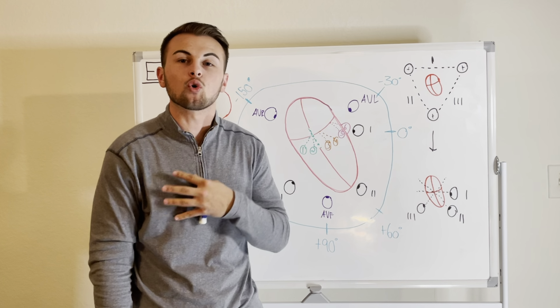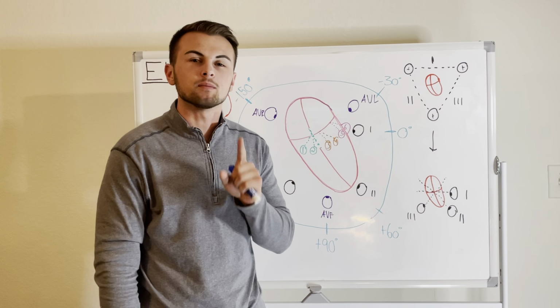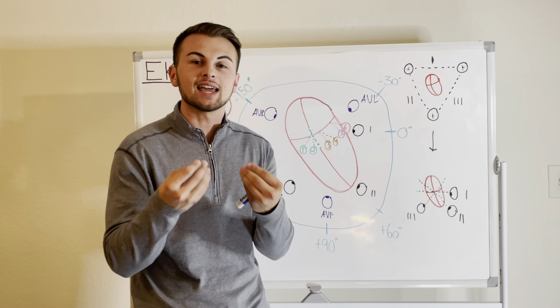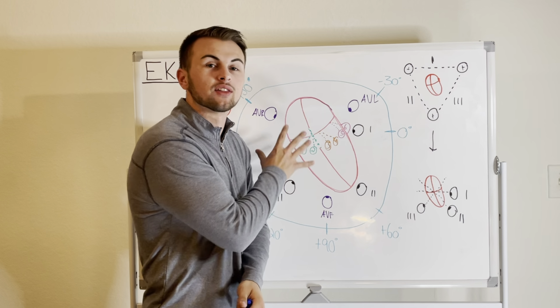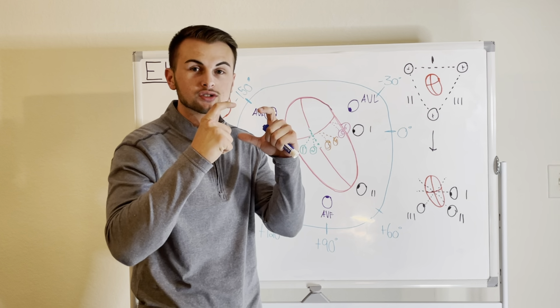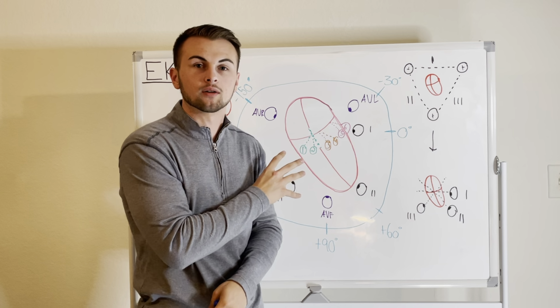we're going to go over the hexaxial system and the precordial system. Now, the most important rule today is that we must remember that the positive end of the leads are like cameras, and they take pictures of the electrical activity that is going on in the heart. That is what the EKG tracing is. It is basically the information or pictures that our leads have taken of the electrical activity of the heart.